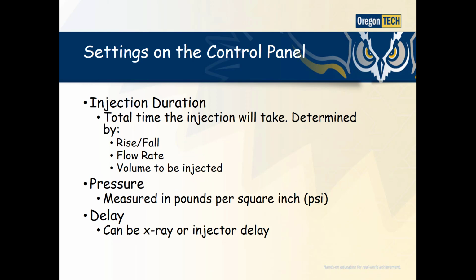Injection duration is going to be determined by the rise fall, by the flow rate, and the volume to be injected. In other words, you're usually not going to set injection duration. It is the result of the other selections.